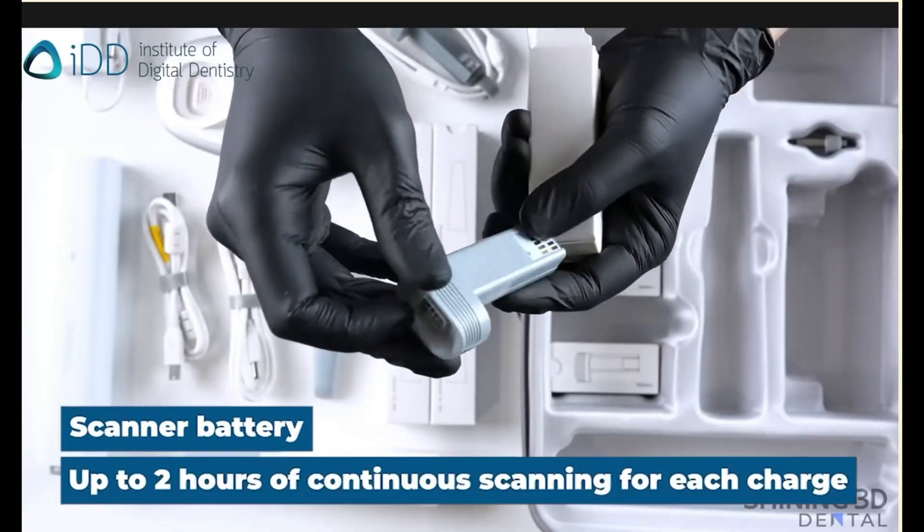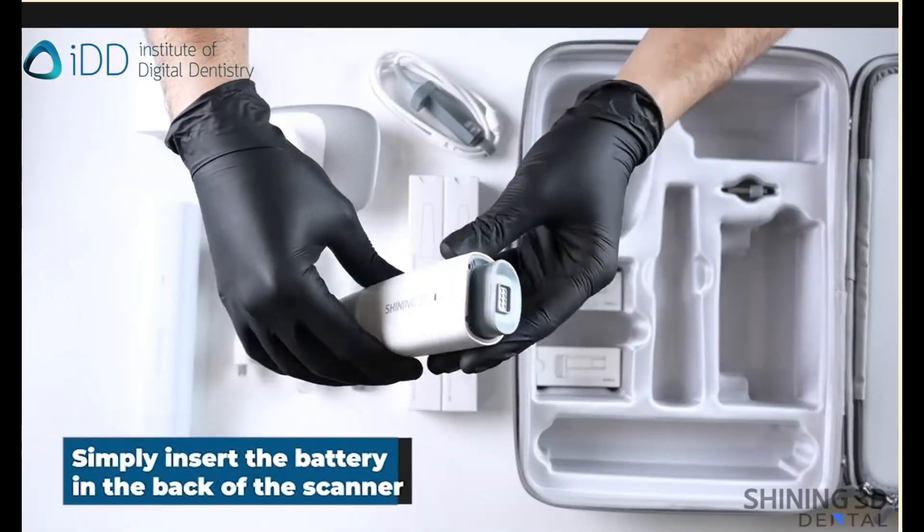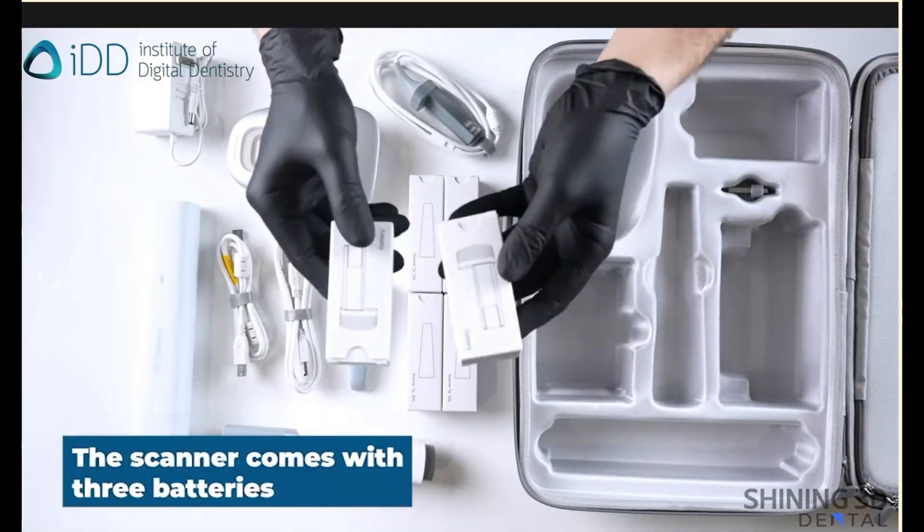Three batteries are supplied, each with the potential for two hours of continuous scanning. That should be more than enough for your daily use, as long as you are diligent in charging the batteries overnight.